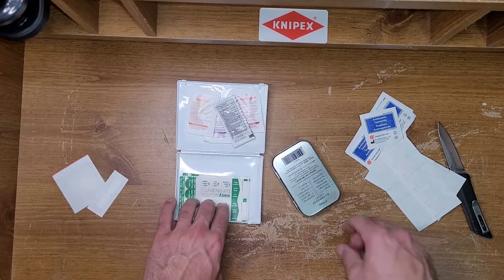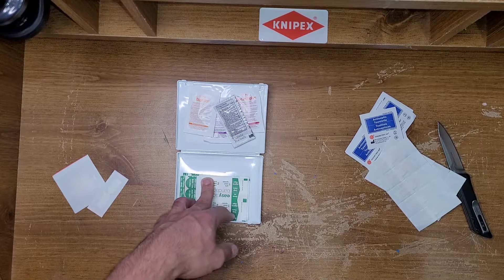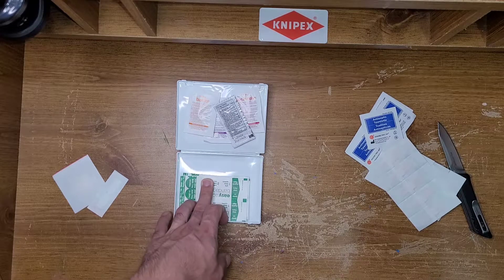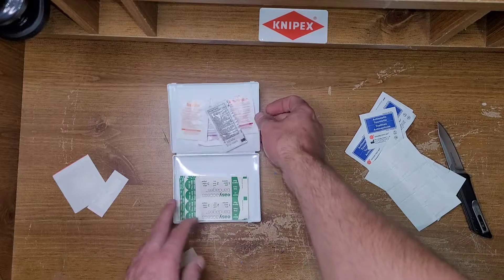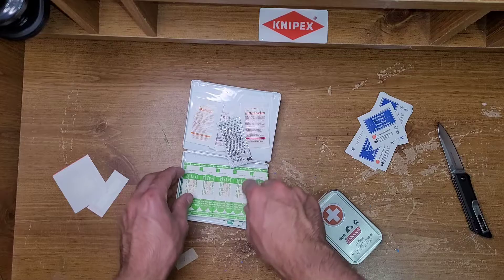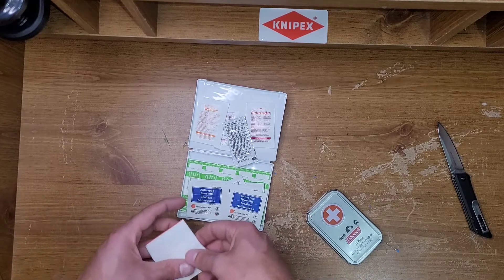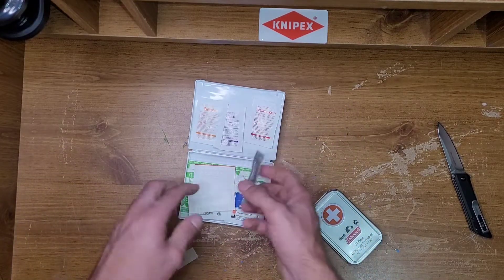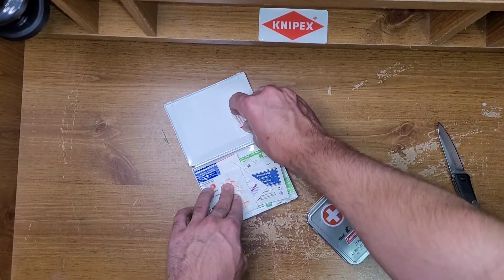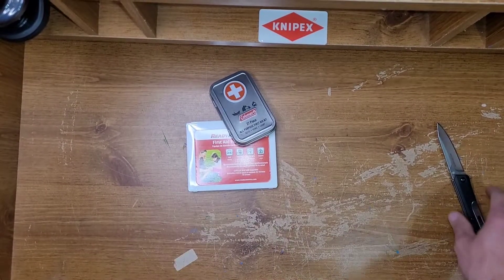I like that this one had pills in it. What did the other one have instead? It had safety pins and a razor blade, which I don't understand. It had some more band-aids and sting relief pads. I like the pills better. I would have liked to see Benadryl or diphenhydramine in here too, instead of or alongside something else. But yeah, pretty neat. This one I think was more expensive — around 10 bucks, or they were both around eight bucks or so.